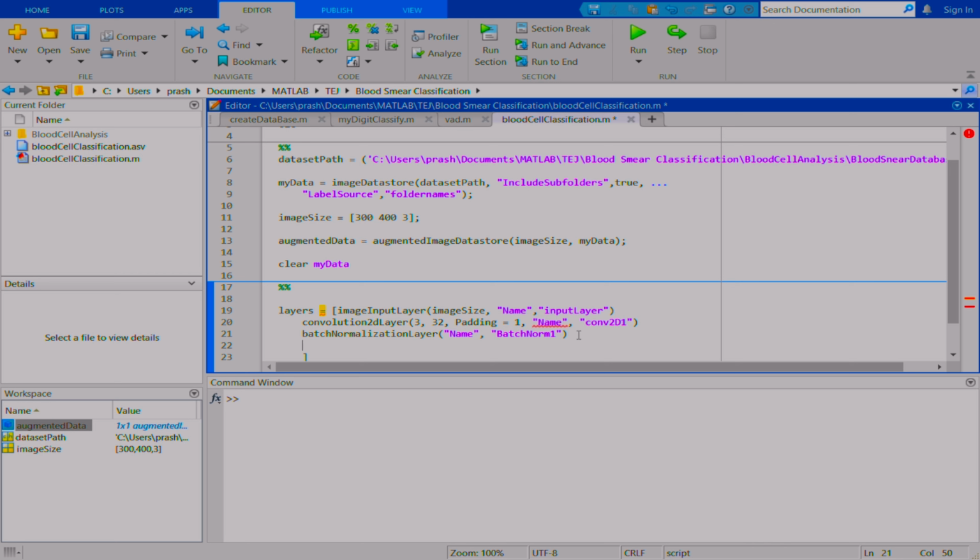So then we need an activation at the end of one set of layers. The input will give the data to the hidden layers, starting with the convolutional 2D layer, and pass it on to the batch normalization. Now you need to activate, right? So neurons should activate. In CNN, which is the activation function? It is ReLU.